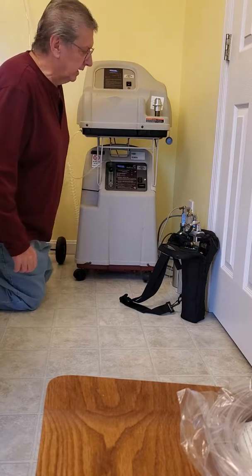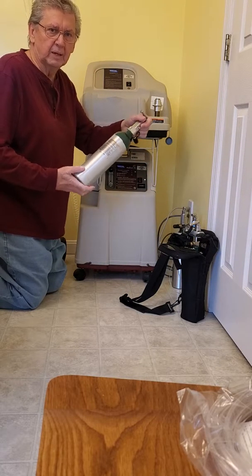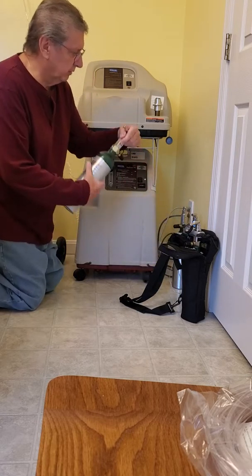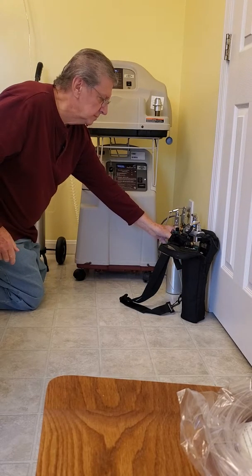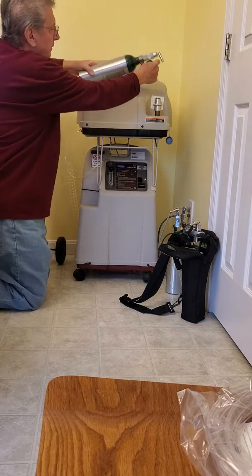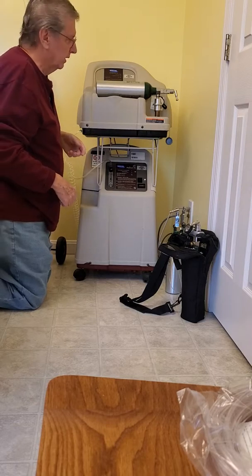If you're making a short trip to the doctor's office or somewhere, there are these small tanks that have about two hours of oxygen in them. These can also be refilled from the refiller unit. You just put them on, turn the machine on, snap it in, and it's going to fill your tank for you.